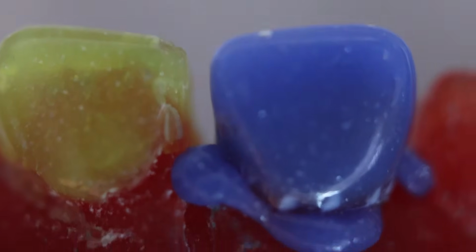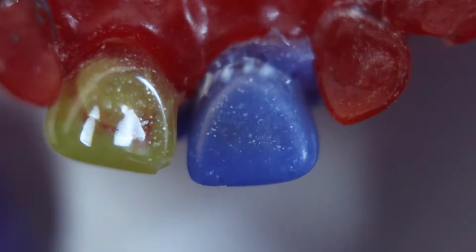So you can now visually see the excess has come out from the margins. A little excess on the palatal side also. So now you need to carve or remove this excess part.